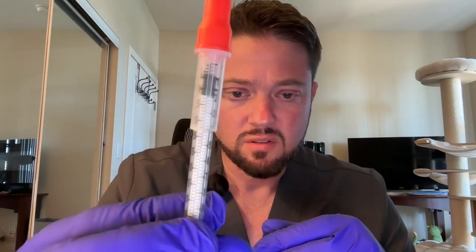With the cap still on, we want to draw this up to the prescribed dose. So we're going to go ahead and go to our MAR, we're going to check our orders again, and our order states that we're giving 8 units. So we want to pull back on the plunger to the 8 unit mark. And if you can see this on the camera here, it's actually a little hard to get that on the camera, but at the 8 unit mark, we're going to go ahead and pick up our vial. We're going to remove the cap.